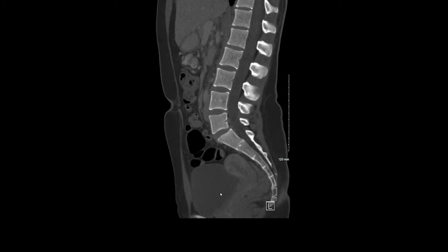That concludes my tutorial on a basic search pattern of a CT of the abdomen and pelvis. Thank you for your time and attention.